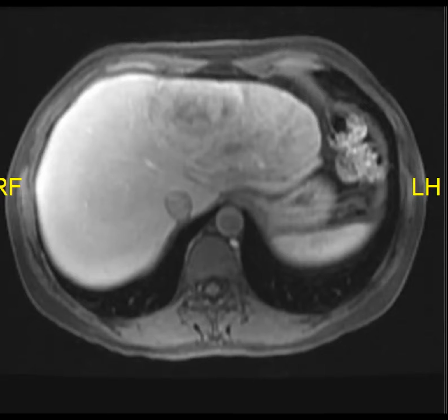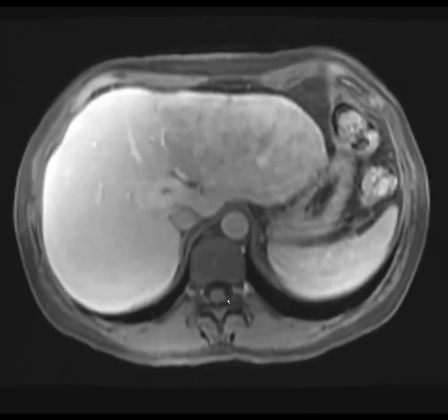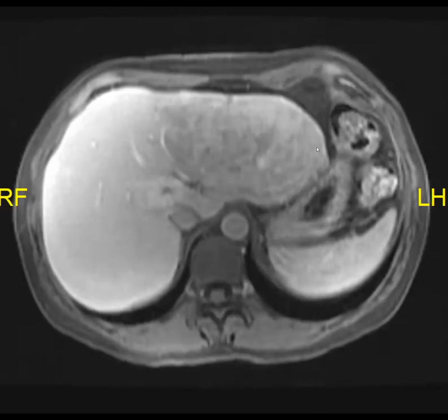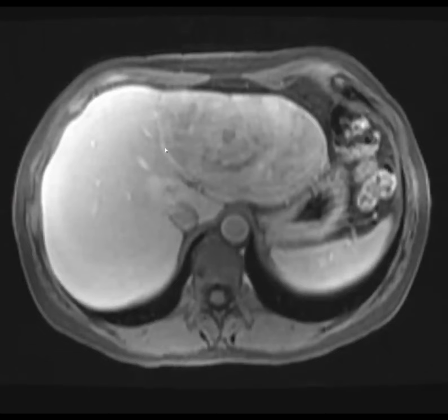So I showed you three lesions which are very similar in appearance. When patients have healthy livers, we just provide a differential diagnosis because preoperative diagnosis may not be possible, and we really cannot diagnose even HCC without pathology in patients who have healthy livers. This is because these patients can also have adenomas that enhance very similarly. They can have neuroendocrine tumors, METs, which enhance very similarly. So in patients with healthy livers, with this pattern of arterial phase hyperenhancement and washout, we have to get a biopsy for diagnosis. I'm kind of surprised that they all went to surgery without biopsy beforehand.